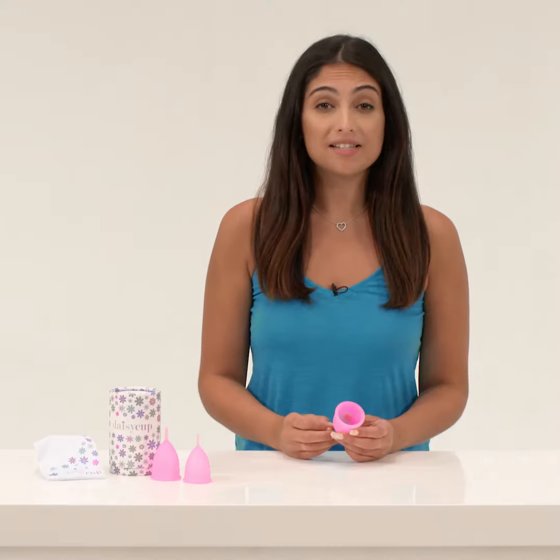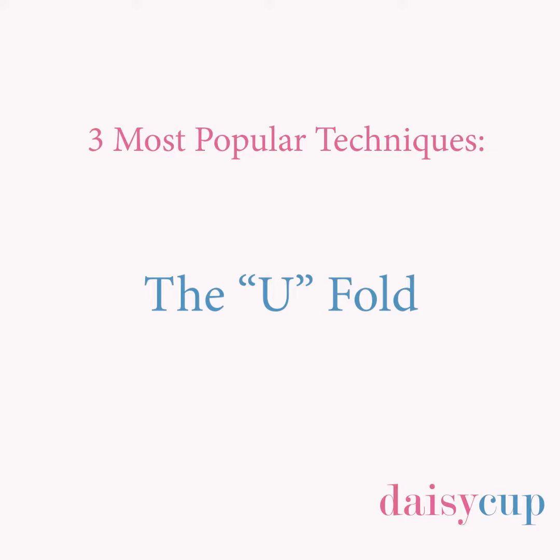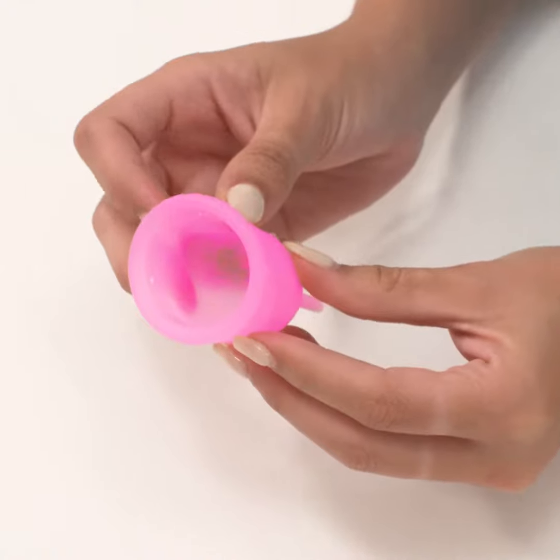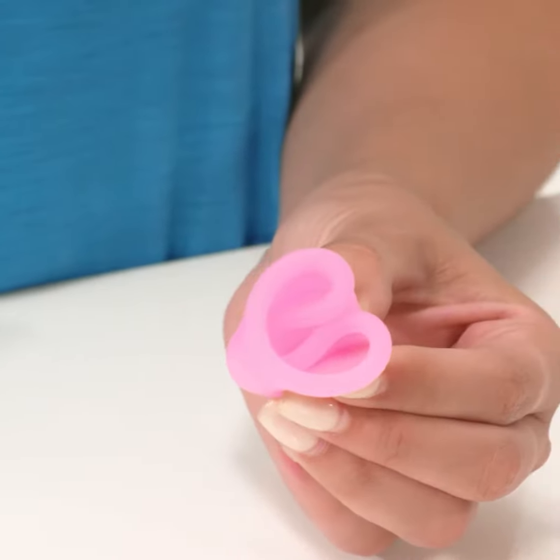Step 2, fold. Daisy Cup is made of a soft, medical-grade silicone that's designed to enter smoothly and comfortably. It's all about the fold. Here are the three most popular techniques. The U-fold: first, pinch the sides of the cup together, then fold it in half so it forms a U-shape.